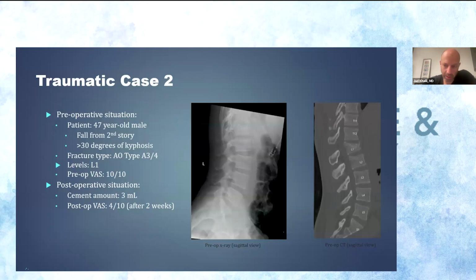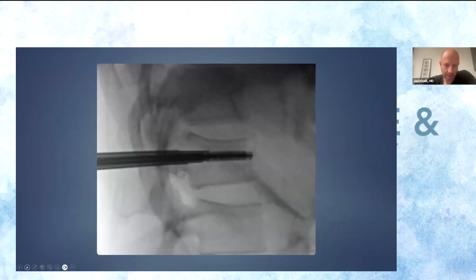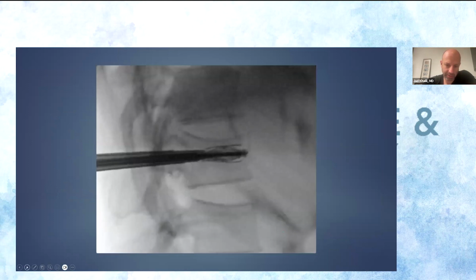So we wanted to be a little more aggressive, just give him a fixation that is not going to fall apart. So in addition to the spine jack at L1, we also offered fixation. He had a little superior end plate fracture at L2, so I bypassed with screws, went down to L3. And again, I always do the spine jack first. Anti-kyphotic maneuvers are done first.